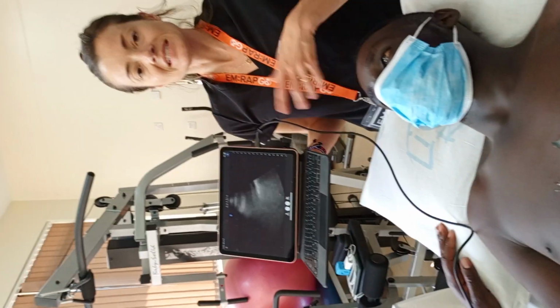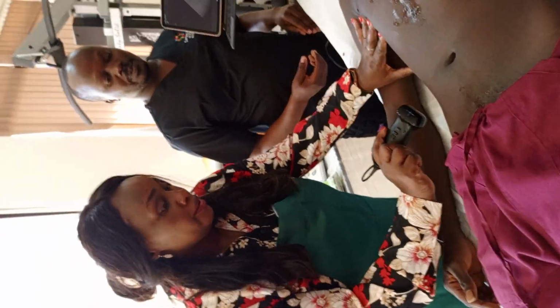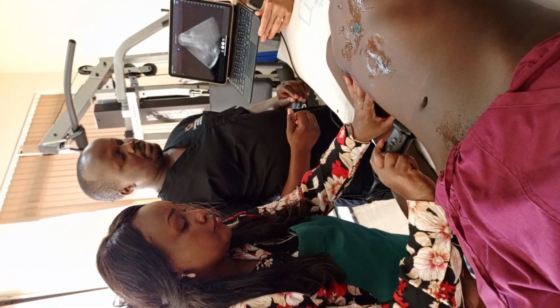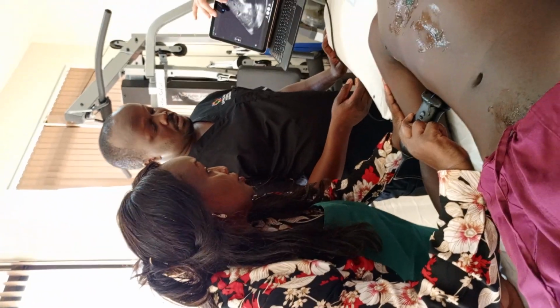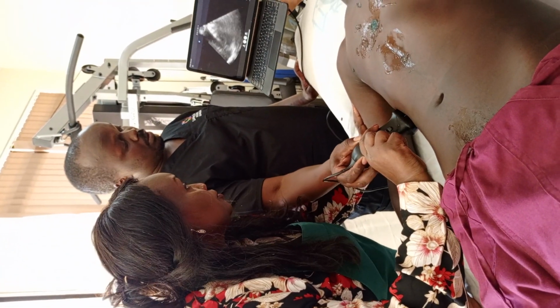All right, so let's get you guys doing it. The thing to know about this is there's obviously a lot of power, so you don't have to push it. You're gonna just let the drill do it, okay? And beautiful. So we're already starting to see a very important organ that is the liver. So here's our liver. But now where does our kidney live?